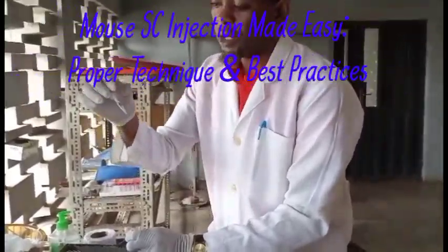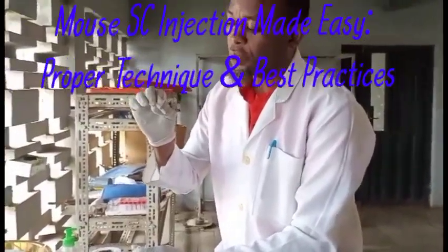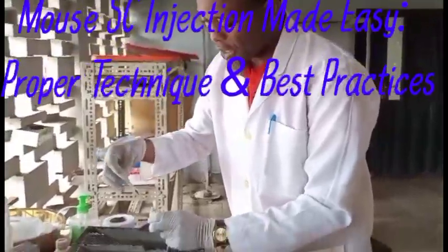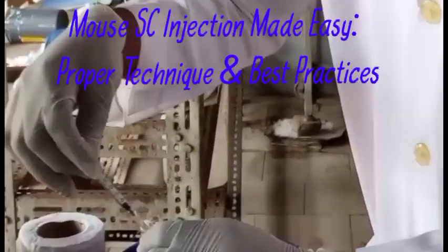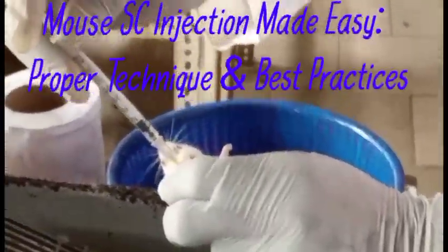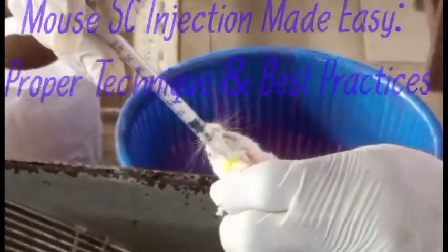So you've already taken the measurements. Say, for me, for example, I'm using 0.1 for my dose. So I will administer it here, ensuring that my hand is stable, at an angle of 45 degrees. Then you release the dose.